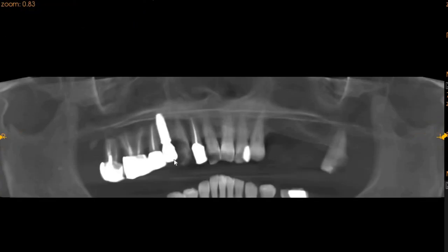Moving to the panoramic view, the upper left canine is carious and will need to be extracted, whereas the upper left first premolar is an edentulous ridge.